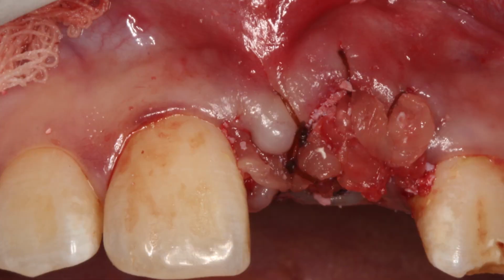So here is a photograph depicting how we basically wedged the CGF into the sulcular area with multiple sutures. That is simply going to allow a nice seal and growth of epithelium over the open socket space without necessarily having to advance the flap and causing more surgical stress to the area.